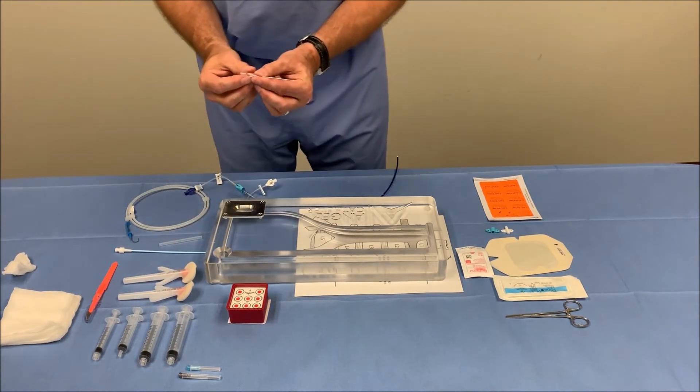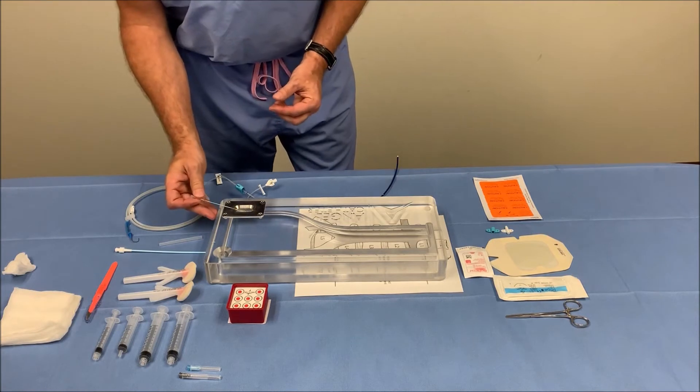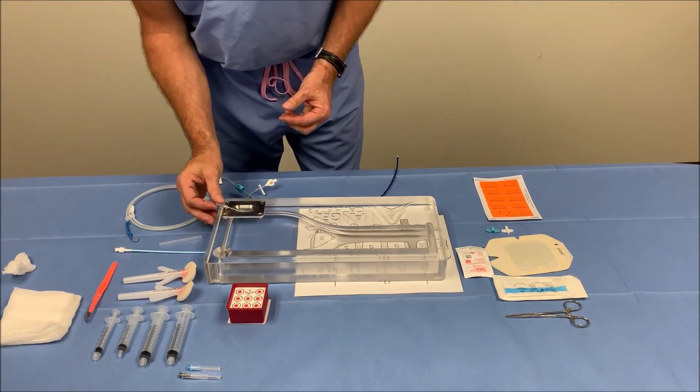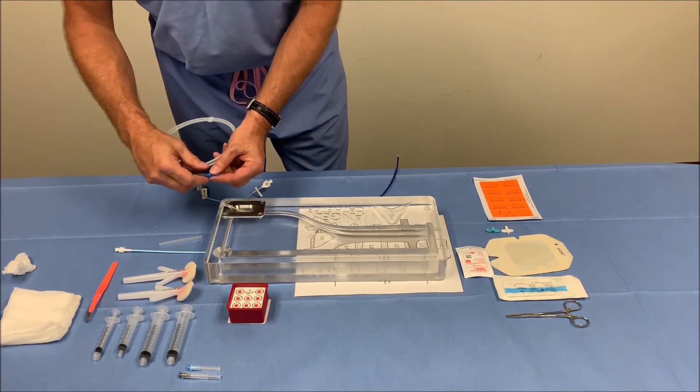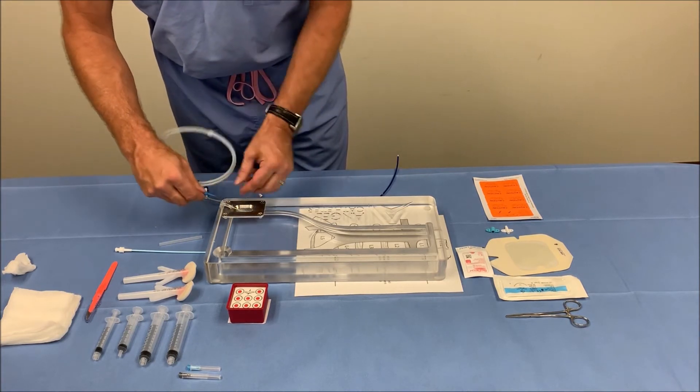You will access the femoral vein by using the Seldinger technique. If you want to use ultrasound you can, go ahead and access the femoral vein. Now we're going to insert our 0.035, 100 centimeter wire.